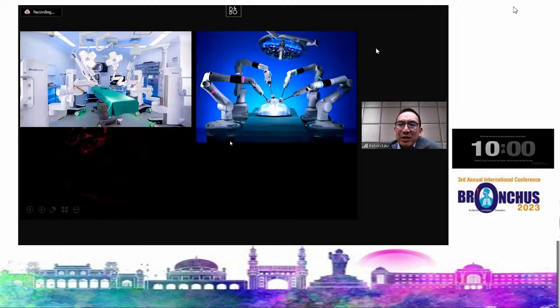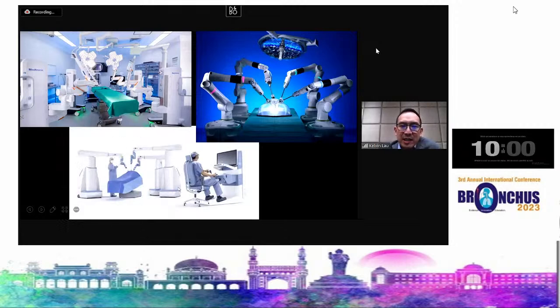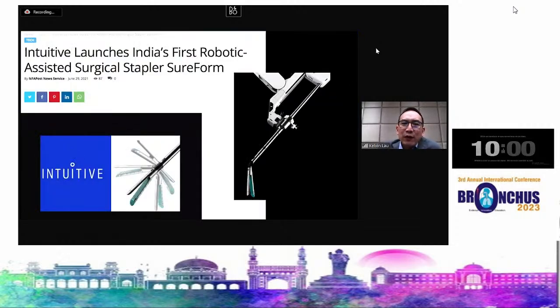So this is Hugo. Hugo has four arms, but they all come in individual carts. And they're not the only one, because Transenterix also does that. This is CMR Surgical's Versius. And then Transenterix's Senhance also does it. These are all just breaking down the one single four-arm robot into four separate arms. They say it's more versatile, but I think actually you just make the footprint of the robot much bigger. So you've got less is more. We decided surgery is getting smaller, more intricate, you want to remove less lung. Why are we making these bigger? So I'm not so sure.